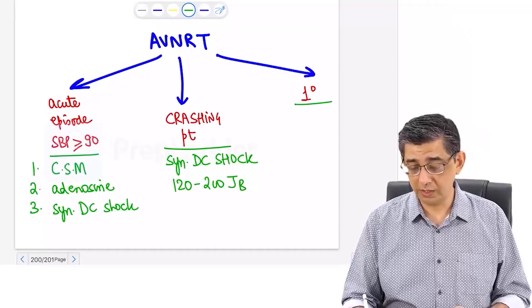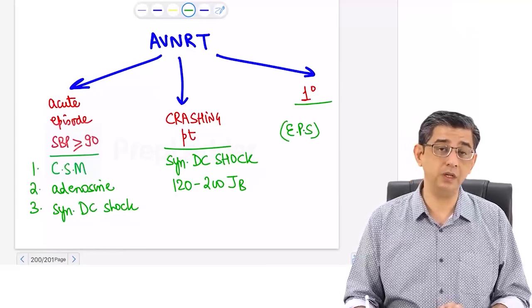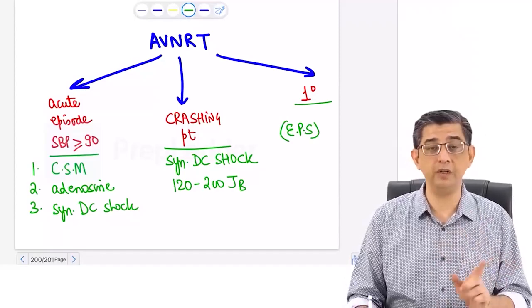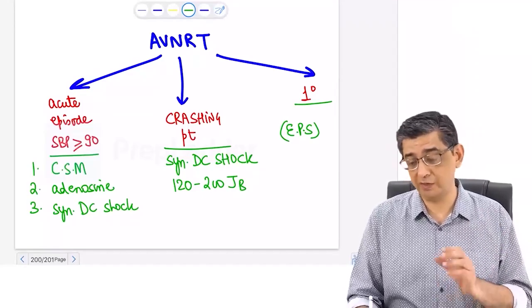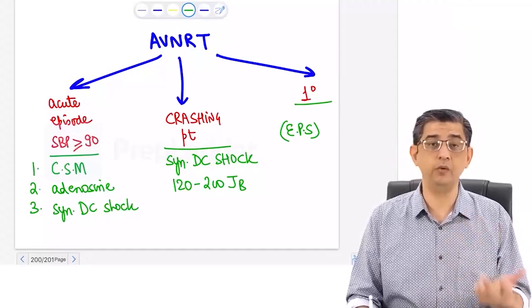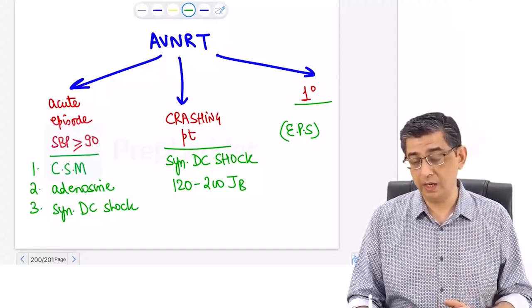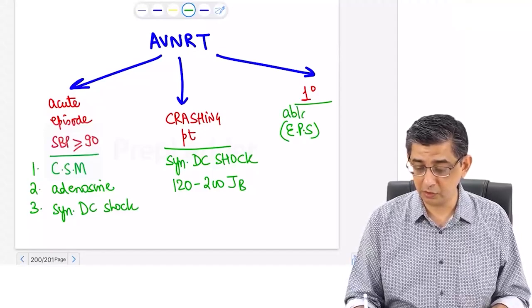So what I can do is first do electrophysiological studies. EPS is a special study which can map out the heart, which can actually track the flow of the current, like I was saying, retrograde conduction, antegrade conduction. Routine ECG electrodes cannot pick it up, but we have special electrodes by which we can map out the heart, we can pick up the ectopic foci, we can map out the flow of current, whichever way it flows in the heart, and then we can go in for ablation of this abnormal circuit which is contributing to the re-entry phenomenon.